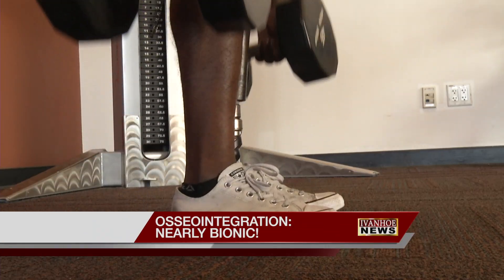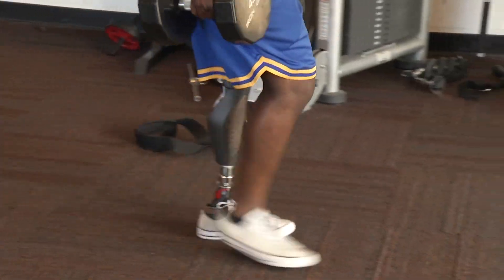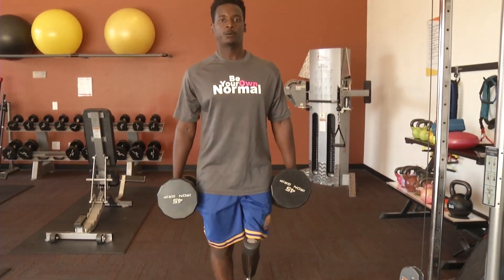For most of us, lifting 90 pounds is not easy. But imagine doing it with only one leg. It's one of the many challenges Munya Mahiya has tackled, thanks to a near-bionic prosthetic.